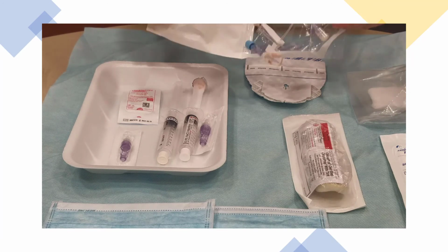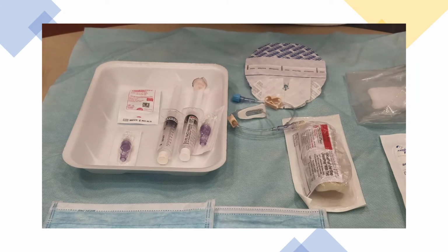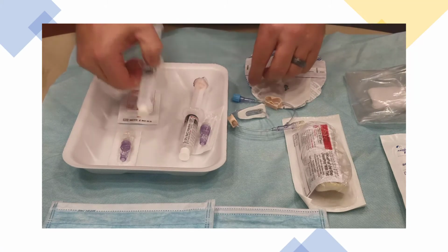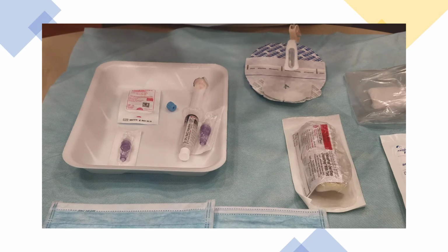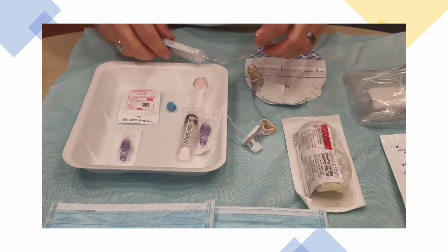So keeping everything sterile, you open the packaging, flop the needle down. It's going to be flushed. Make sure that we have all the air out of the Huber needle. You should see a couple of drops here in just a second on the sterile field, which will indicate that everything is flushed.